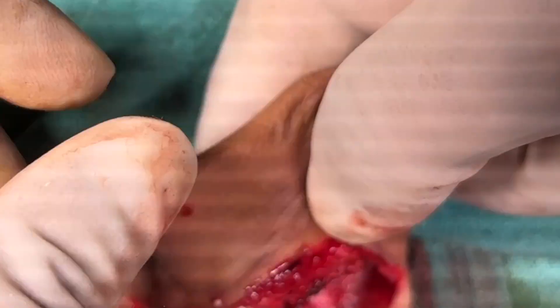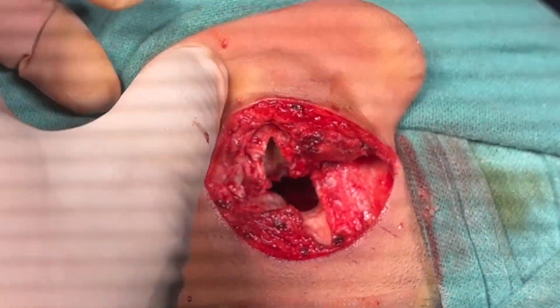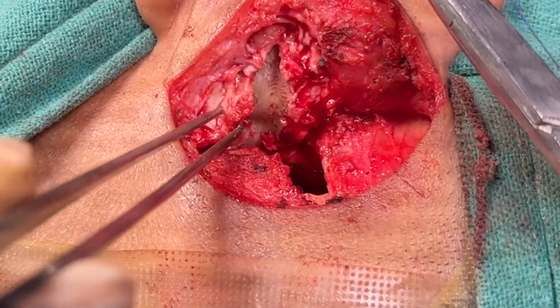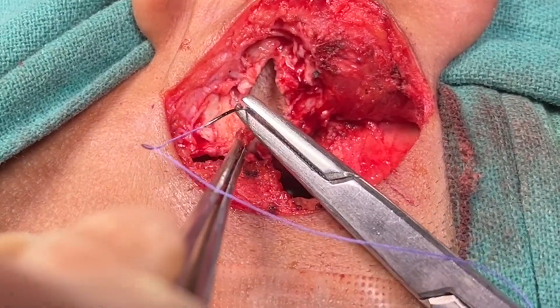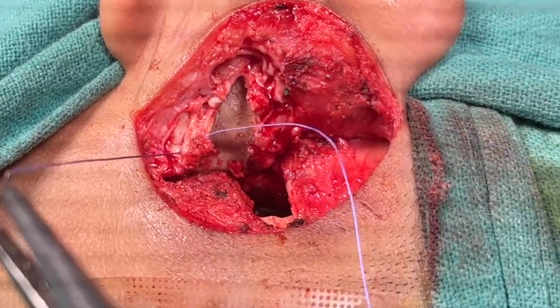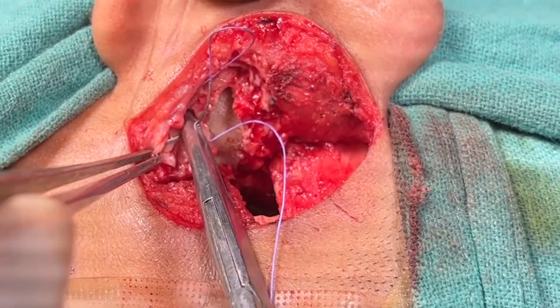By inserting your index finger from the meatus, you can check if the removal of the concheal cartilage is sufficient — it should easily pass through the meatoplasty site. Now we have to suture the superior and inferior flaps with the surrounding soft tissue. I am suturing the inferior flap with the soft tissue.